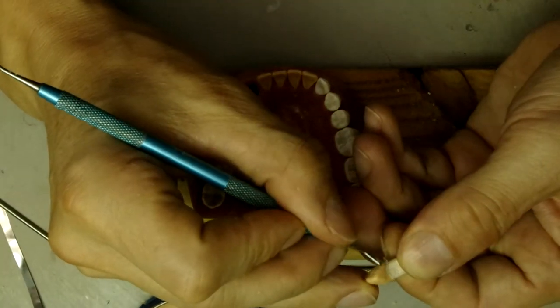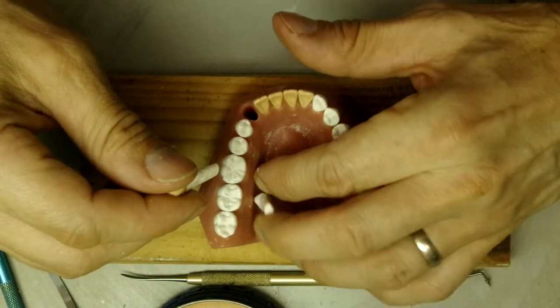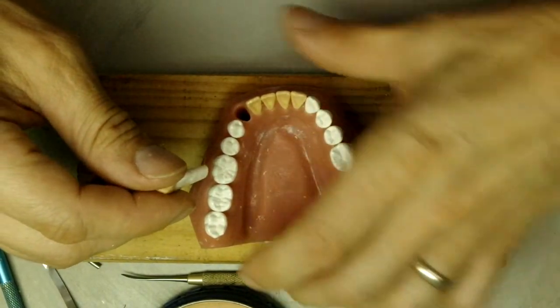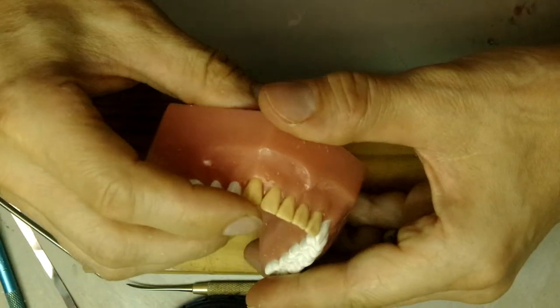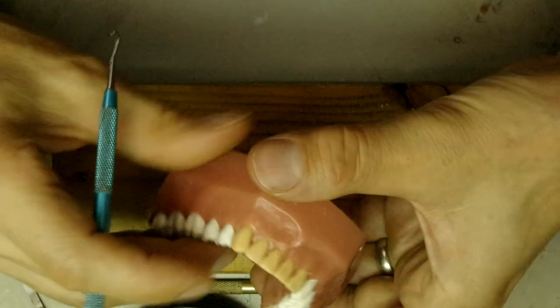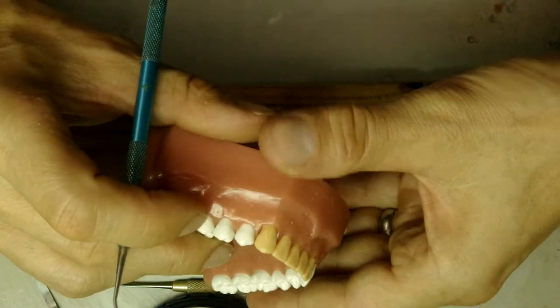So there we go. The lower left canine, tooth number 22. Don't lose the teeth, $5 a pop. See, once you put the right height of contouring, it shouldn't be popping out the tooth.